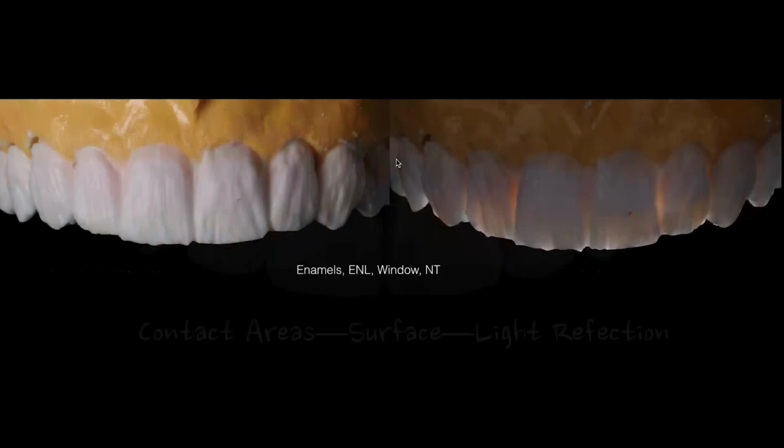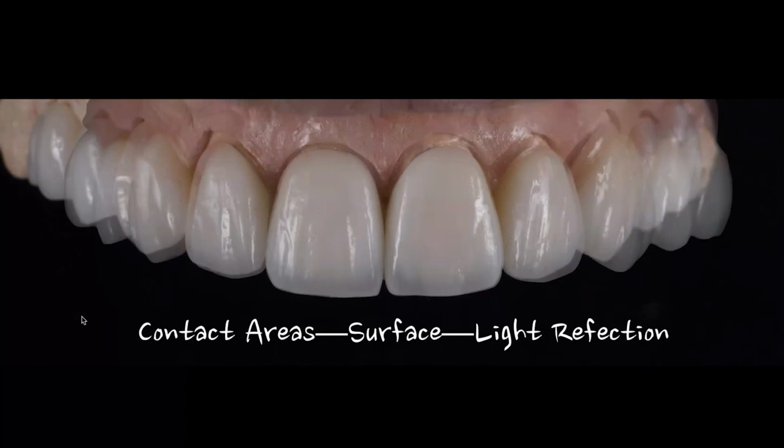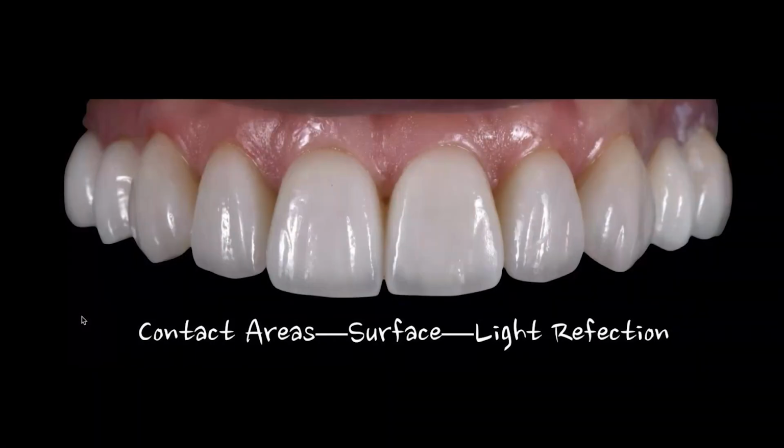And the reason I actually put this case in was because in the end, she wanted super white and bright. And the only way I could really compensate for the length and the super white and bright was really in the surface, right? I had to really kind of make a little bit more of a surface area on these teeth to kind of make them flow a little bit. And again, notice the light reflection, right? Line angle, distal, see the middle third of the central, middle third of the laterals, both of them are the same.